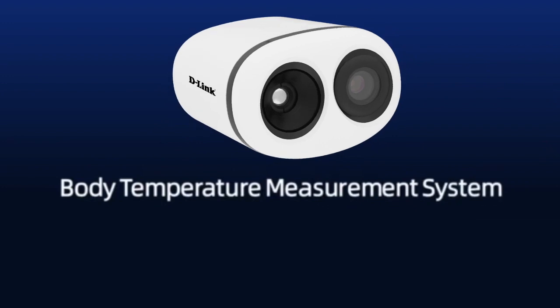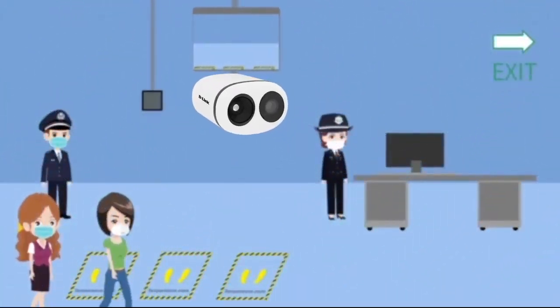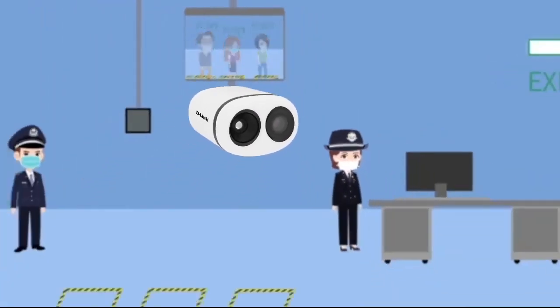A body temperature measurement system — quick installation guide. To prevent and control the infection of novel virus, please wear your mask and measure your temperature in public.